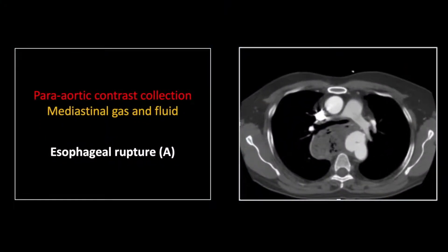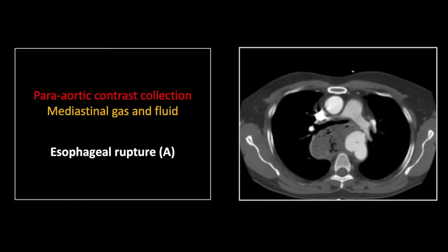Our next case is an esophageal rupture, also associated with an aortic laceration and pseudoaneurysm. You can see the pseudoaneurysm on the anterior and right aspect of the descending thoracic aorta, a little lower than the typical level. There is also a well-circumscribed collection of gas and fluid in the mediastinum. In traumatic esophageal ruptures, rapid tissue expansion causes the soft tissues of the mediastinum to knit together and contain the released gas and fluid.